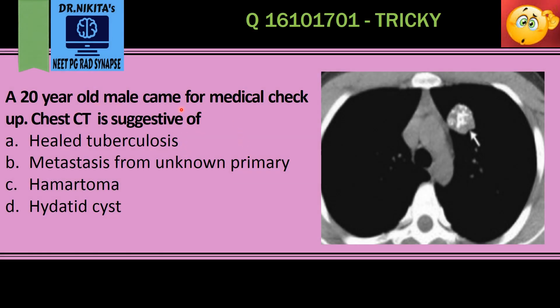We have a 20-year-old male who has come for a medical checkup and a chest CT was done. Why is this a CT? Because the bones are white. Now, is this a non-contrast or contrast CT? It's a non-contrast CT because the vessels — this is the aortic arch — they are not white.